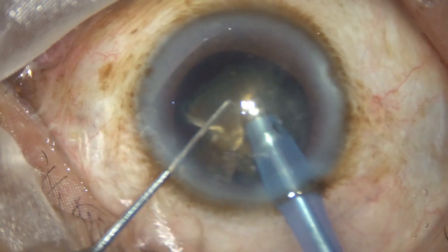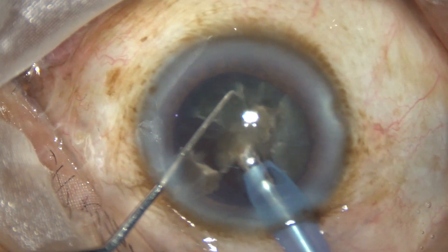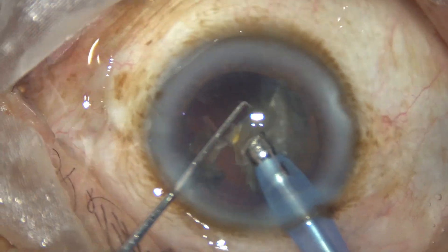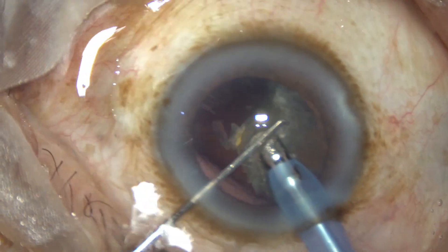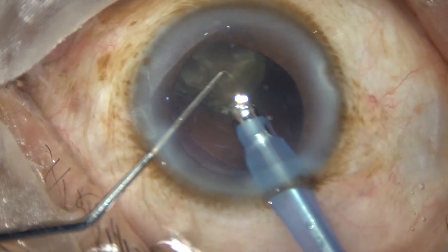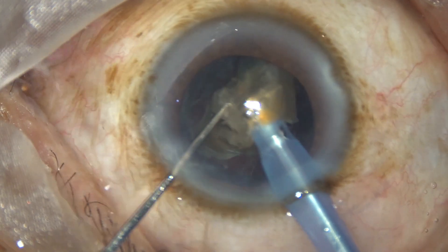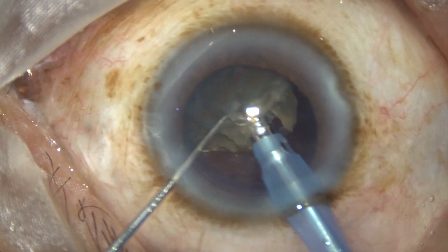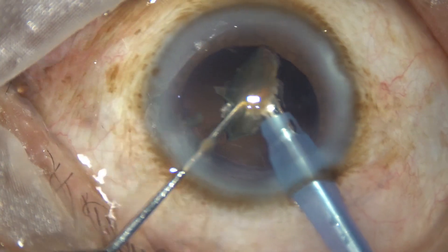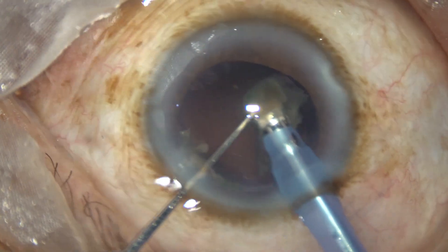Emulsification is started from the apex of the nuclear pieces, because if we start from the other side, the apex can go towards the posterior capsule, exert pressure on a point, and the posterior capsule may rupture. But if we start emulsification at the apex, as in this case, the equatorial part rests on the posterior capsule and protects it while we work on the apex.